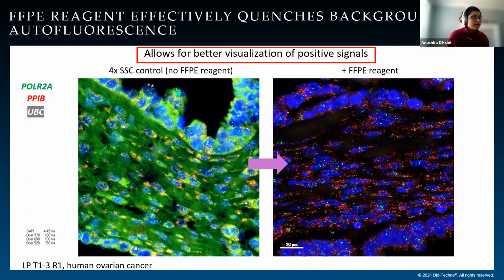So it is not only eliminating your autofluorescence, but it is not masking your real signal. So this really helped us build confidence in how well this assay works for FFPE tissue. We tested this not only across tumors, but different sample types as well.